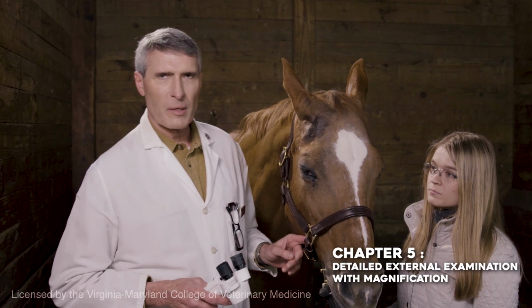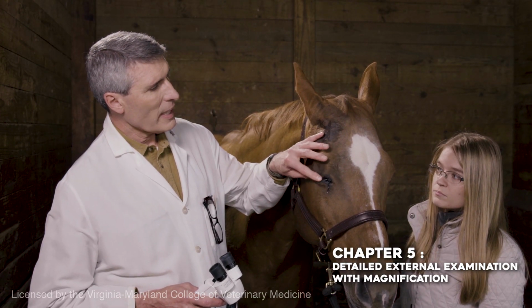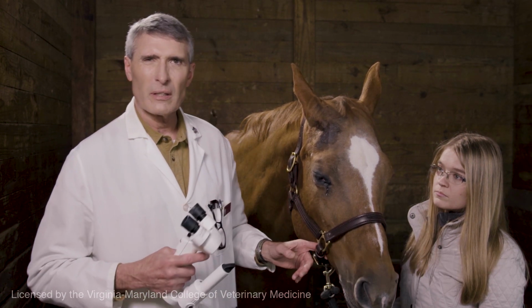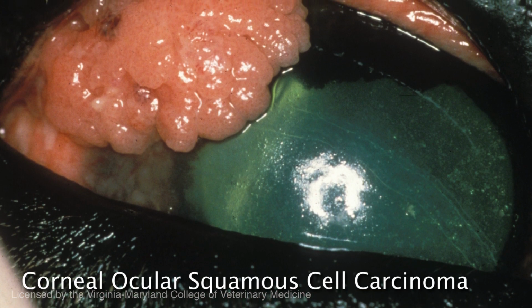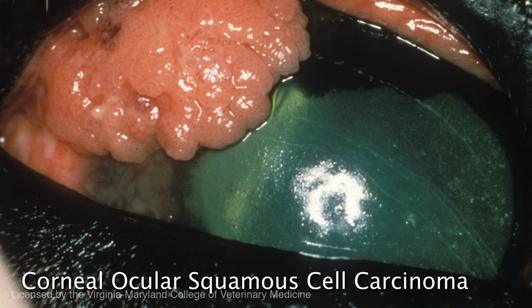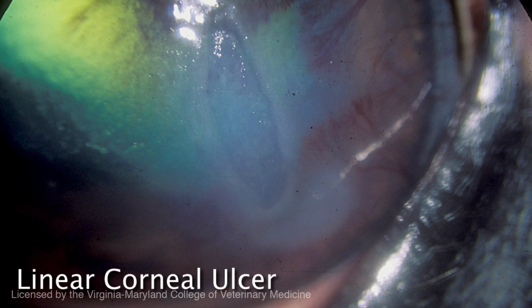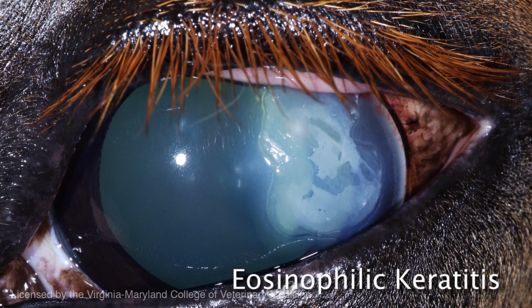So now that we have done our palpebral nerve block and we can easily see the whole eye, this is where we do our detailed external and surface ocular examination, which is very, very important in the horse. We see a lot of surface ocular disease, tumors, foreign bodies, corneal disease. This is a very, very important aspect of equine ophthalmology.